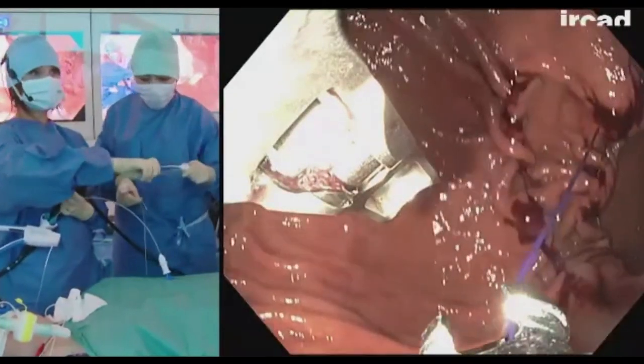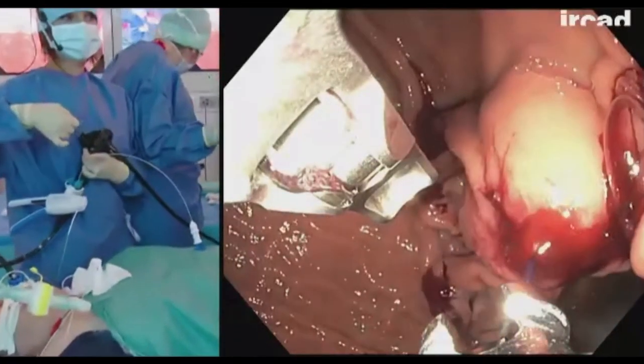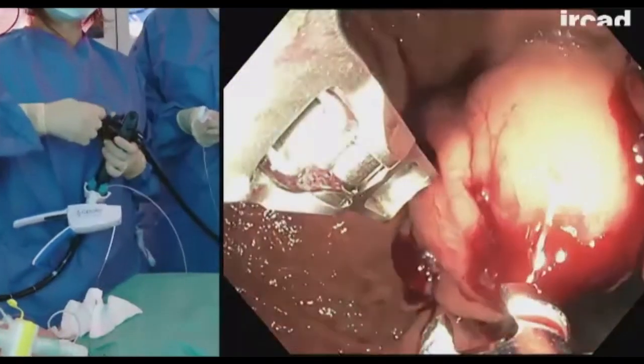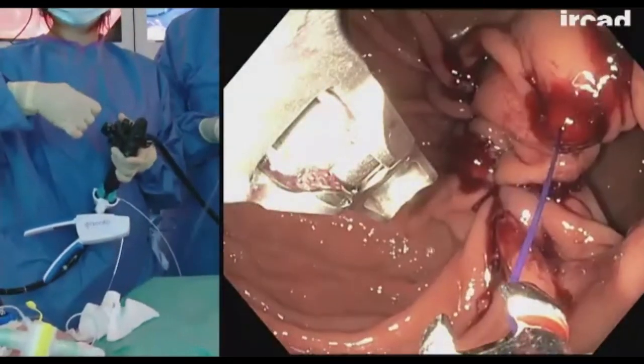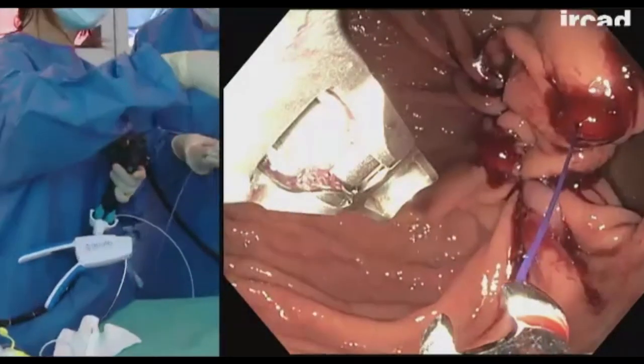Okay, and now we're gonna cinch. In order to cinch and to close to secure the suture, I'm gonna start pre-cinching. And just very gently, kind of tailoring, I would say, the closure. So we have a 50% reduction of the area.